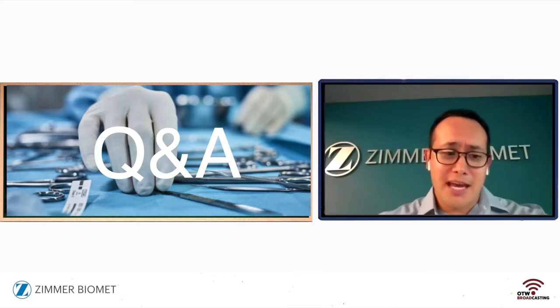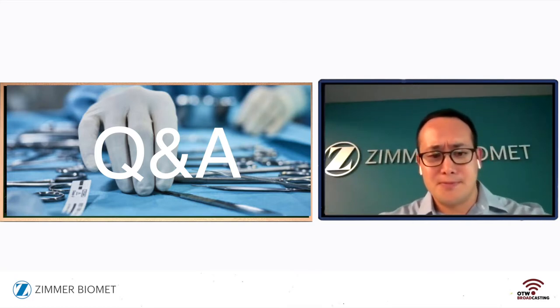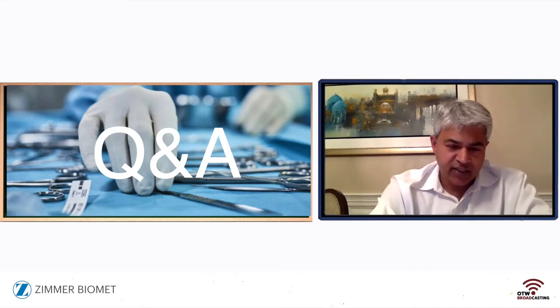Great, Dr. Samdani, do you have anything to add to that question? I think Dan did a very nice job of covering how we handle revisions. I think it's very important to have an access surgeon or another experienced surgeon on board. When you're trying to decide what the best treatment is going to be for that broken tether or overcorrection, you really have to look at how much growth the child has left and how much deformity that breakage may be causing, because many times it'll be asymptomatic.